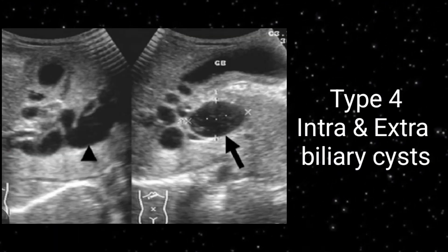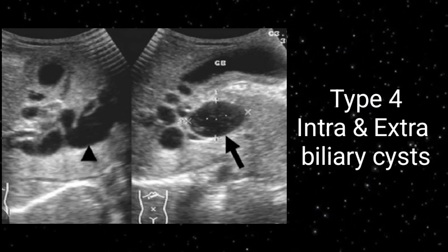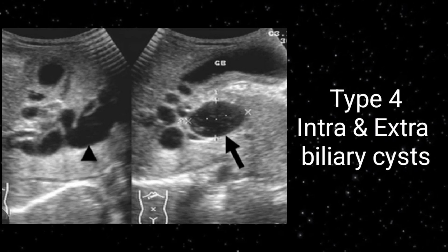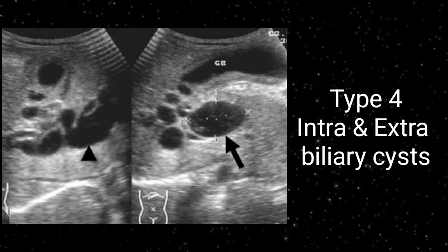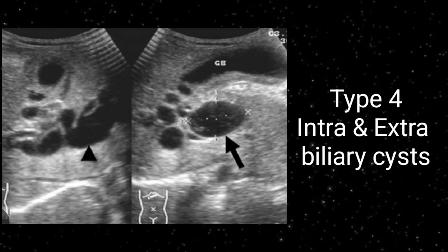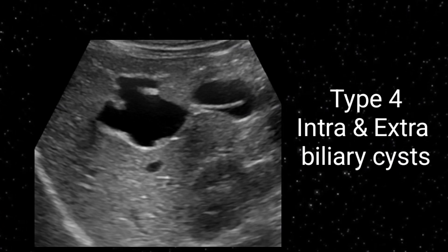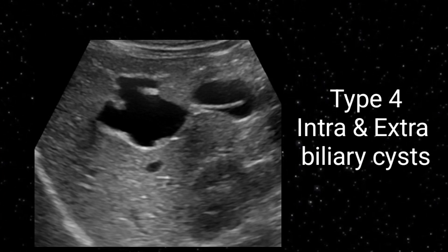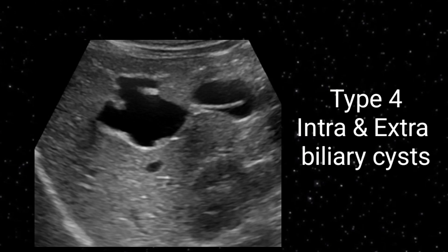Type 4 choledochal cyst is classified as multiple intrahepatic and extrahepatic biliary dilatation. On this image, you can appreciate the gallbladder and adjacent to it there are multiple cystic lesions, alongside a dilated CBD as well. This is an example of extrahepatic biliary cystic dilatation. As Type 4 involves both intra- and extrahepatic biliary cysts, on the next slide there is an image within the liver showing an irregular-shaped cystic lesion — this is intrahepatic biliary cystic dilatation, a particular example of Type 4 choledochal cyst.